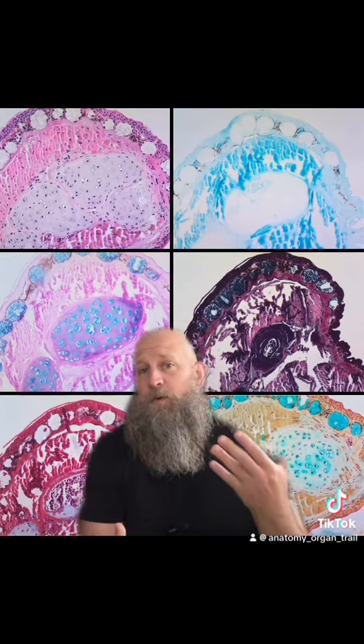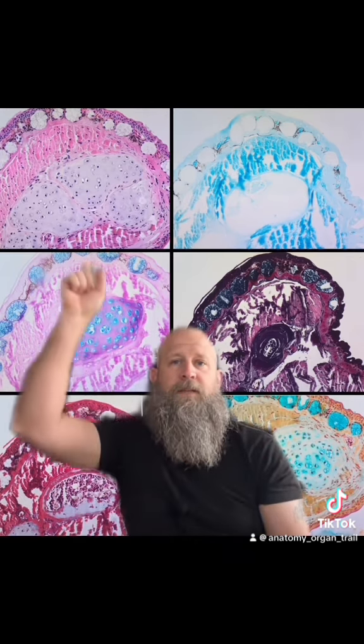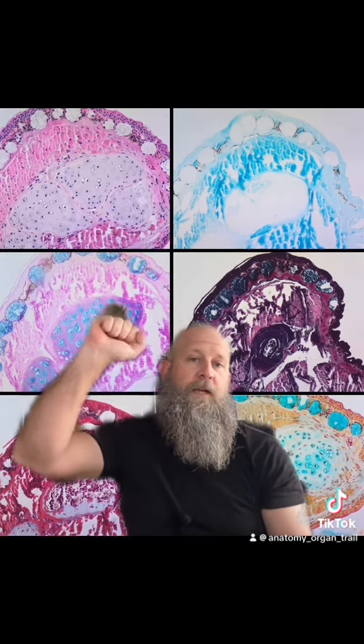The most popular stain, this one up here, is known as hematoxylin and eosin, and it's going to stain the nuclei of the cells a dark purple color, and then the cytoplasm of the cells sort of a pinkish color, so that we can differentiate between the nucleus and the cytoplasm of the cell. This is by far the most popular cytological or histological stain.